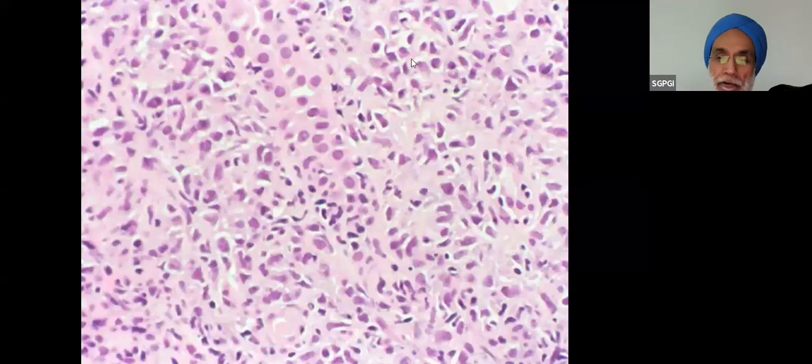Then if there is this irregular serpiginous or geographic necrosis, if the lymphocytes start growing very fast, they outstrip their blood supply. So it's a late-stage finding; it won't be seen in early disease. But if you see this, then again, you have to start worrying. This is PTLD. And of course, higher power will look different. You'll get the sense that you're dealing with a lymphoma.